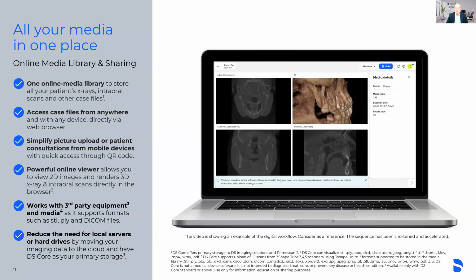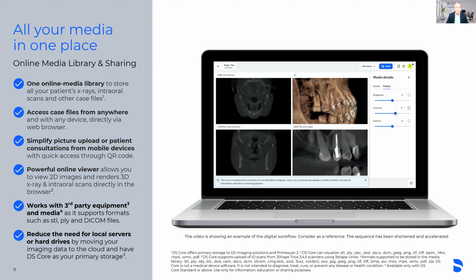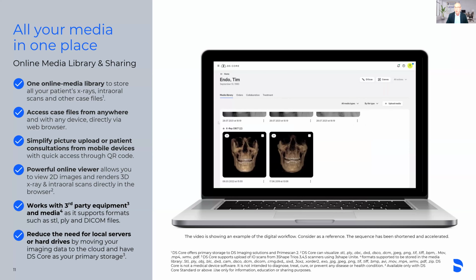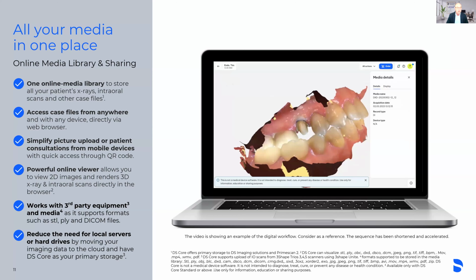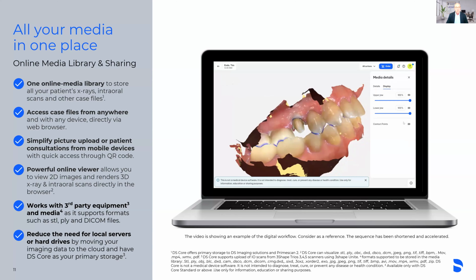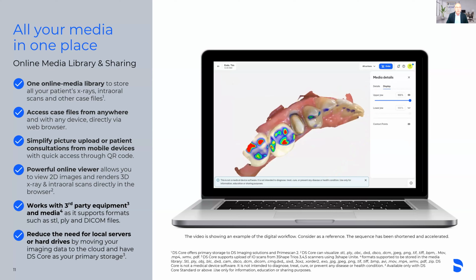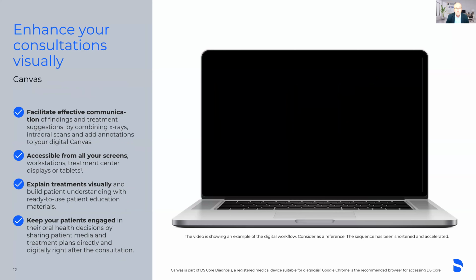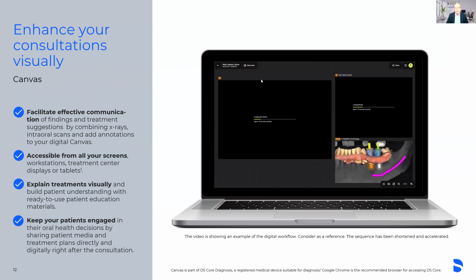The other feature we have is we have a QR code. So we understand that if you're going to be taking a picture of a patient or taking any sort of uploads of patients, you can scan a QR code directly within DS Core and upload directly to DS Core without saving that to your device, which is a HIPAA compliant way of getting data into the cloud and attach this patient file. And it works with all third-party equipment. So this is going to reduce the needs for local servers, hard drives, and having one primary storage place for you in the cloud. And when it comes to consultations, you can enhance your consultations easily with Canvas.